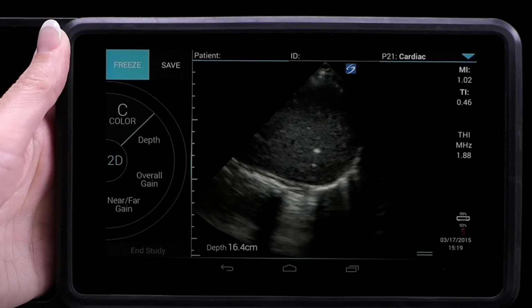Now on our craft, we use the Sonosite iVis. Most ultrasound machines have the same function when it comes down to it. There are lots of fancy bells and whistles, but if you understand some of the basics of the machine, you can really forget about a lot of the other stuff. So this is the basic screen that we see on this machine. It has lots of different functions. I'm going to go through a couple of them, but again, this comes down to practice, practice, practice, and really getting your hands on the machine as much as possible.